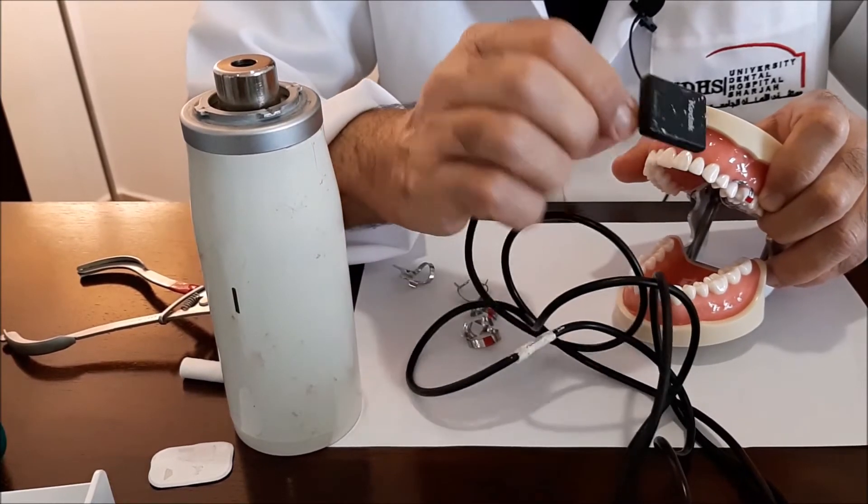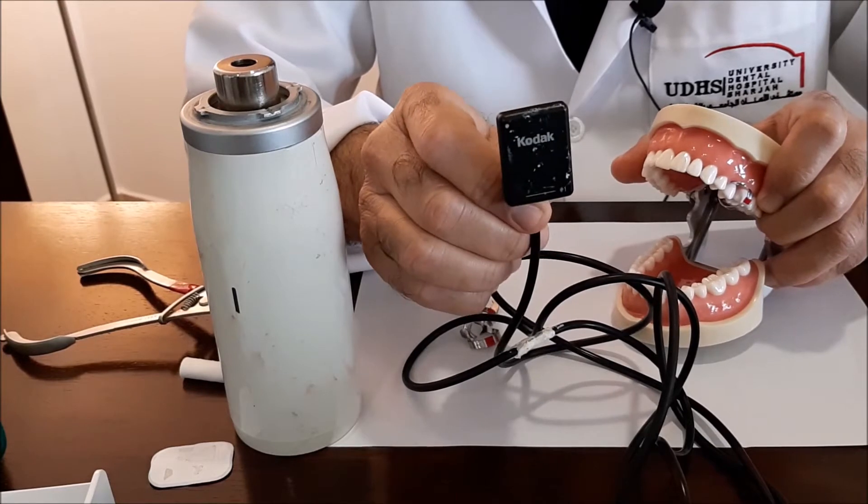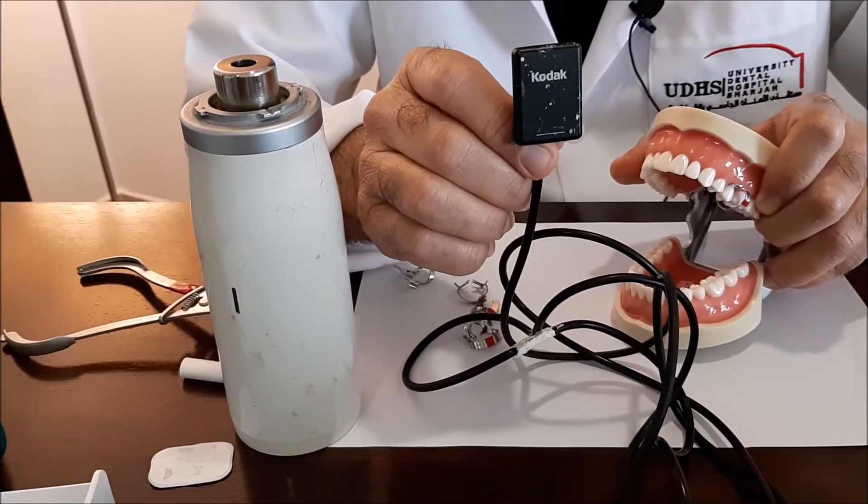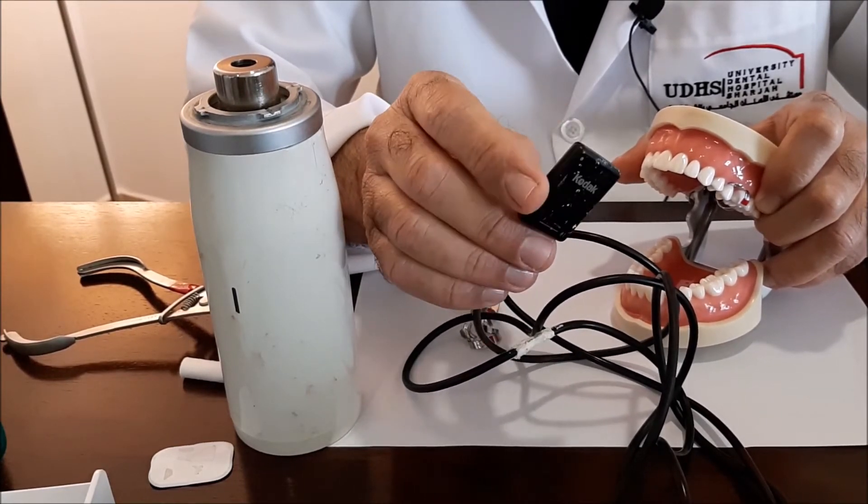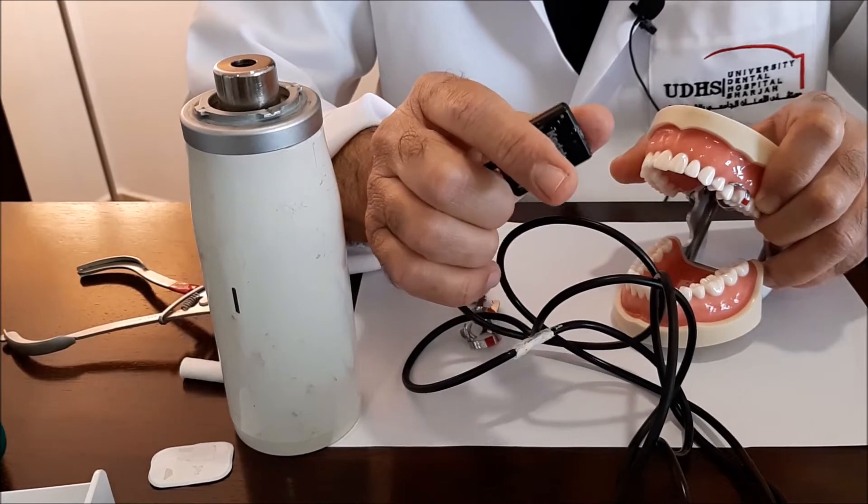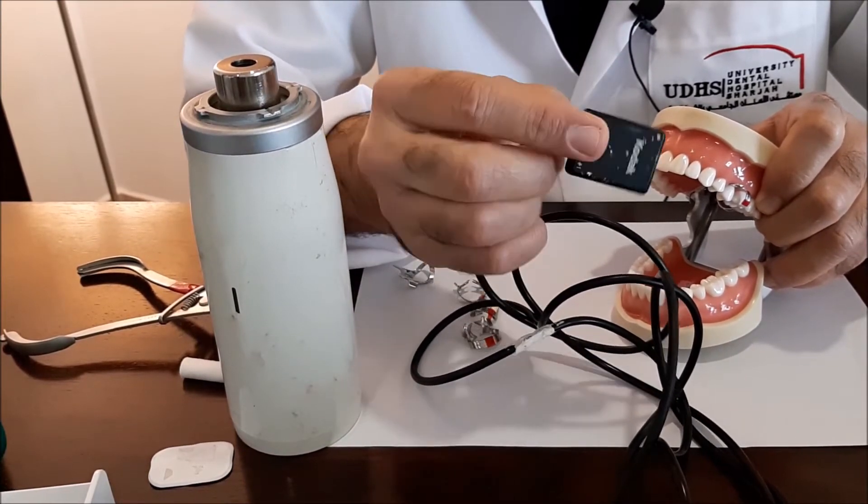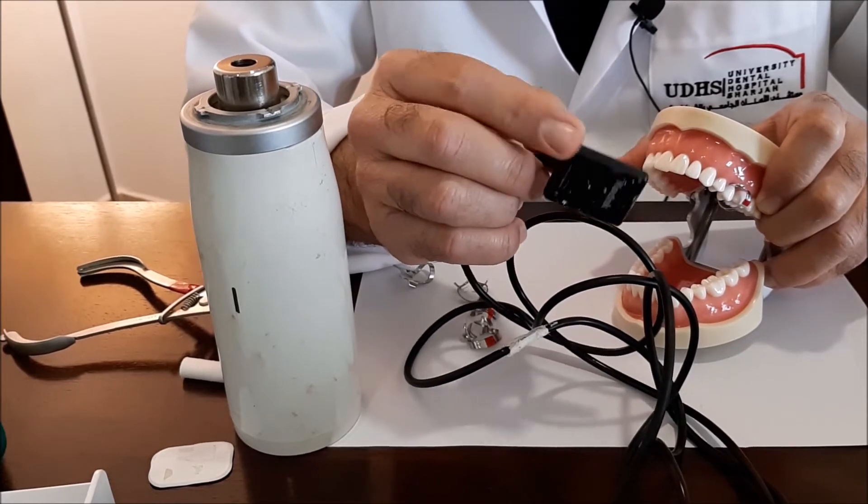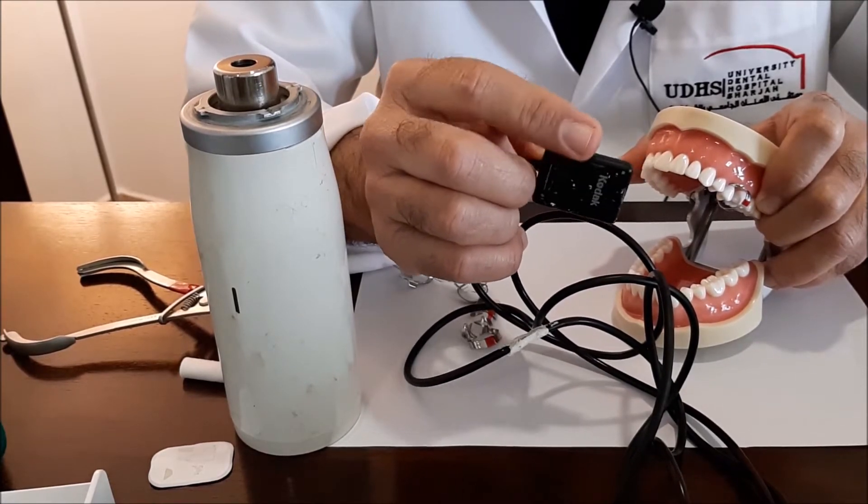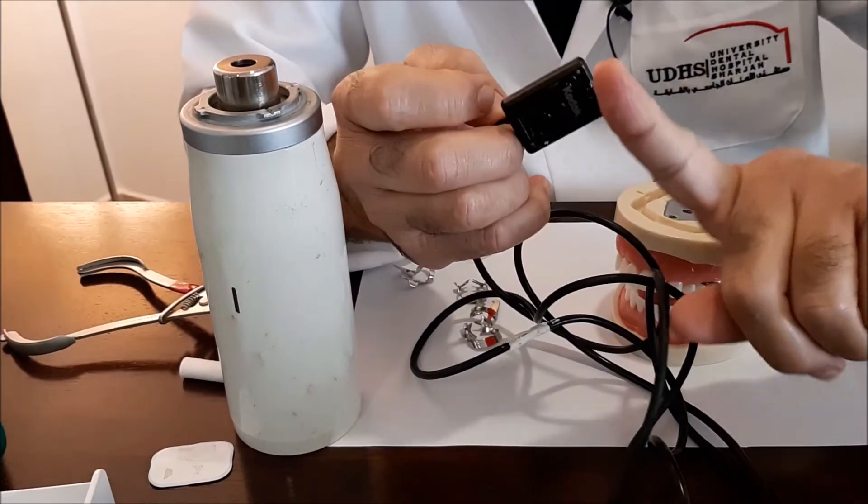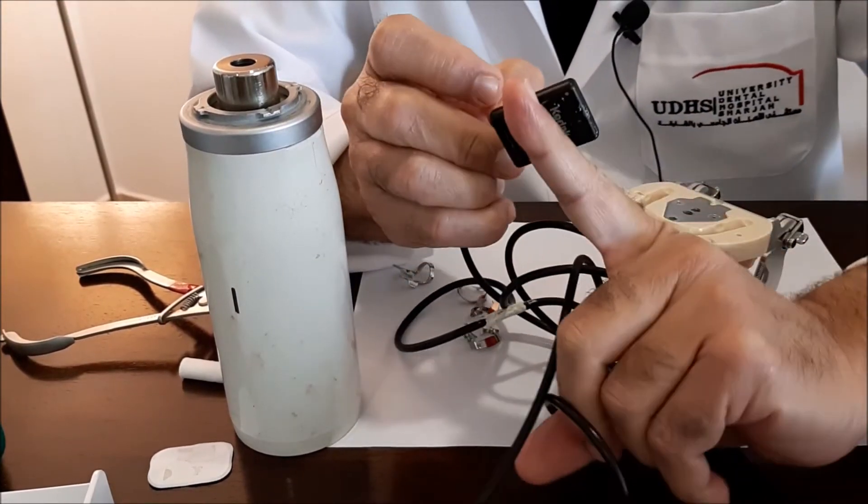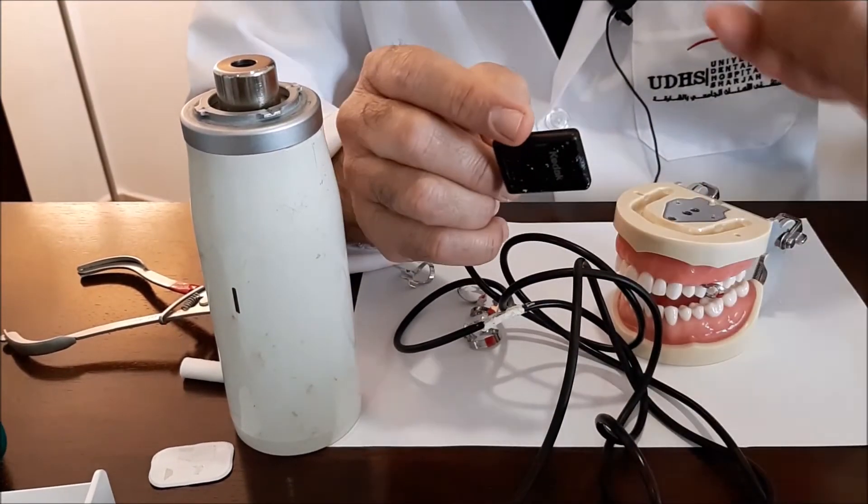However, sometimes it is possible that we place the sensor vertically if we feel that this is comfortable for the patient and if we don't want to miss the apex of the tooth. Sometimes when we place the sensor in a horizontal direction, if the tooth is long we might miss the apex of the tooth.